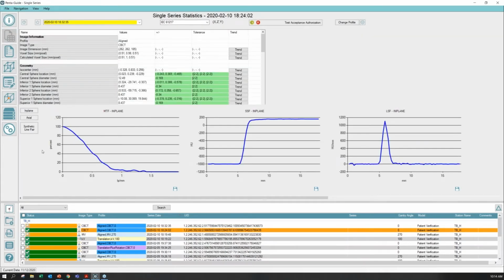So what this is, it's an area that gives you all those metrics that we've just explained. So focus your attention at the bottom of the screen. This is our data grid where you can import all your DICOM files. So you can simply click and drag them into the software, into this window, or you can just click on this add a file import feature.